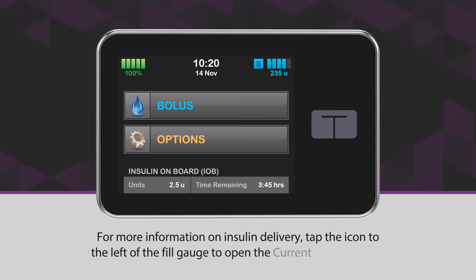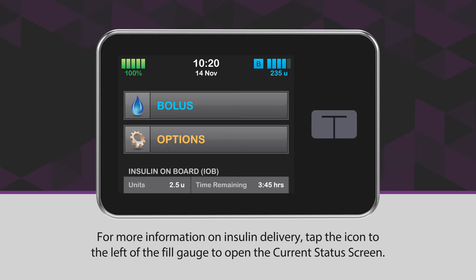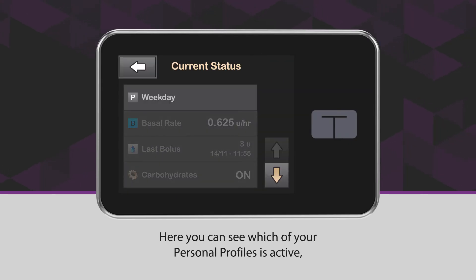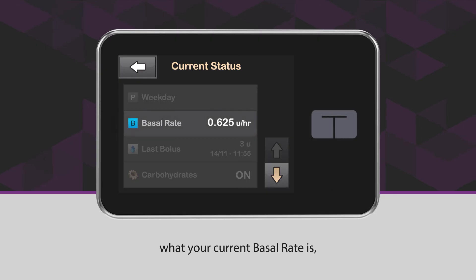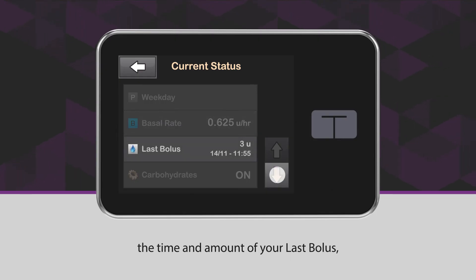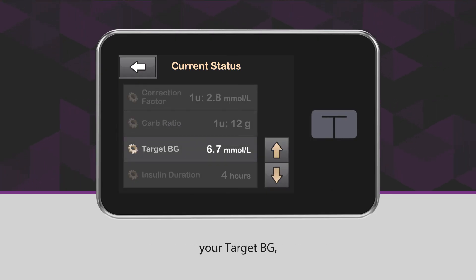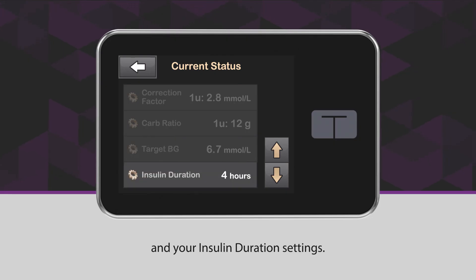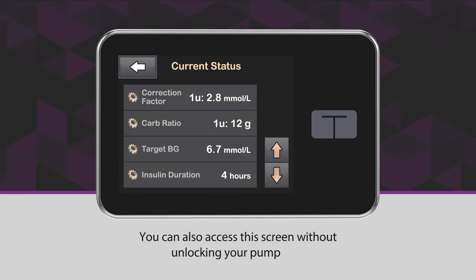For more information on insulin delivery, tap the icon to the left of the fill gauge to open the current status screen. Here you can see which of your personal profiles is active, what your current basal rate is, the time and amount of your last bolus, your target BG, and your insulin duration settings. You can also access this screen without unlocking your pump first.